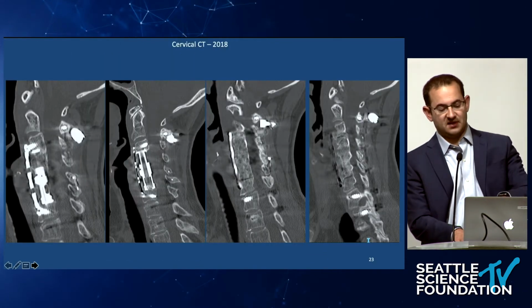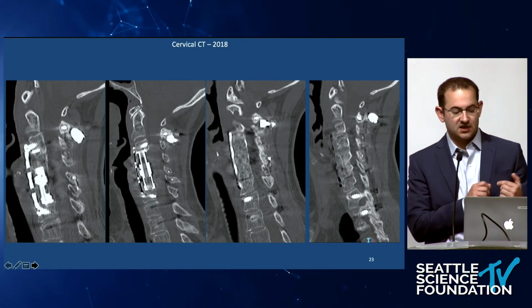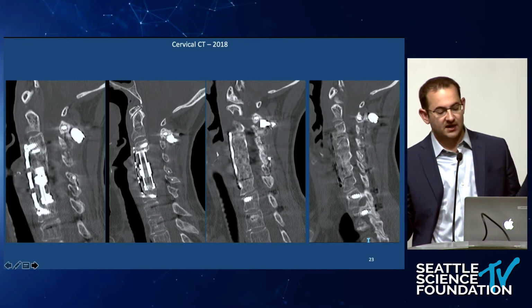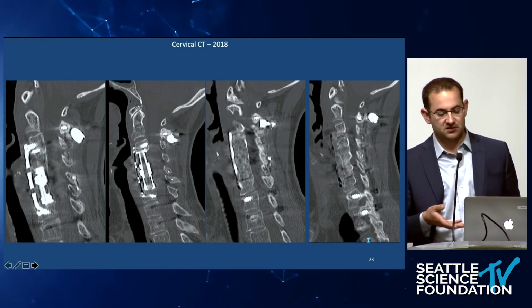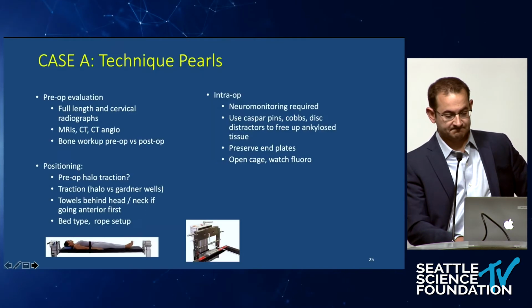This is not the same patient, but this is the type of fusion that I'll get. In the corpectomy cage, we're putting ground up autograft if it's not from an infection or tumor, and then I'm using DBM, other DBM matrices, to put inside the expanded cage as well as laterally to it, and that's where I think we're getting some of that lateral fusion.